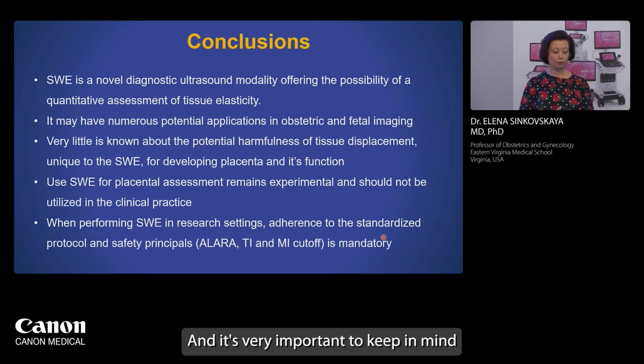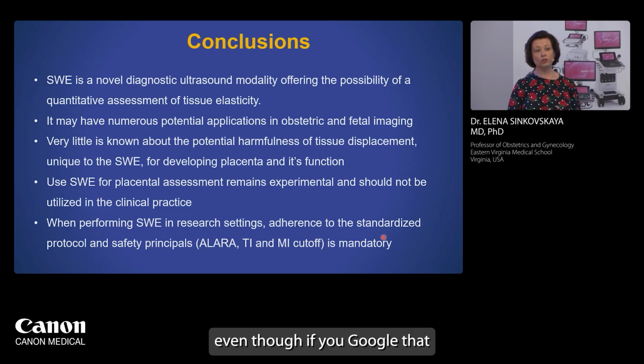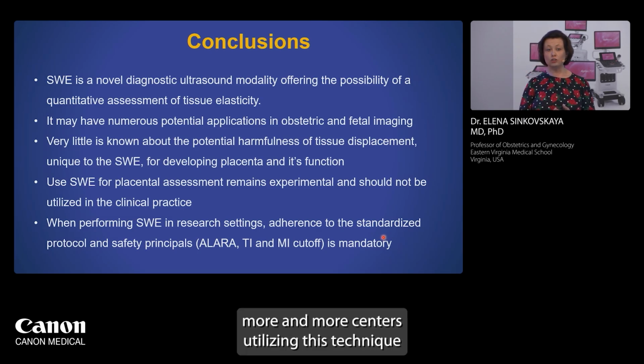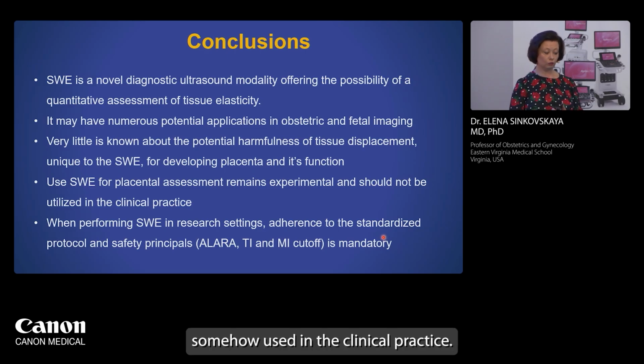And it's very important to keep in mind that most of the time when we use this technique, it's still reserved for research projects, even though if you Google that and look at the literature, more and more centers are utilizing this technique for their research projects. And I believe that one day it's definitely going to be used in clinical practice.